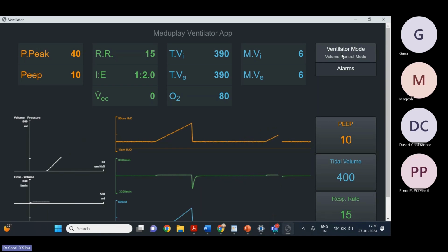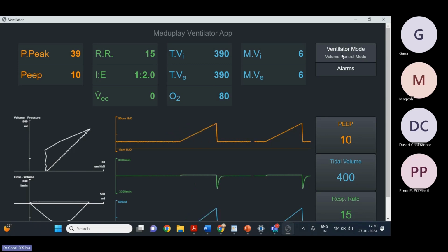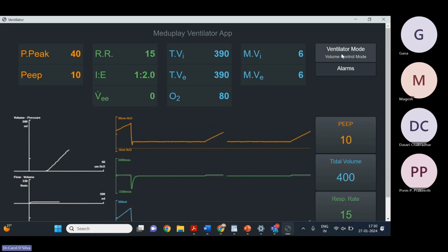In volume control, all you can do is set the volume. At that point, when the patient is critical, you check and differentiate. That's how you will get the plateau measures. Okay, so that is one concept. Now I will switch to this. You understood the volume control, right?